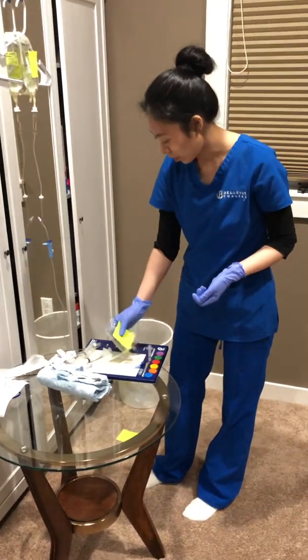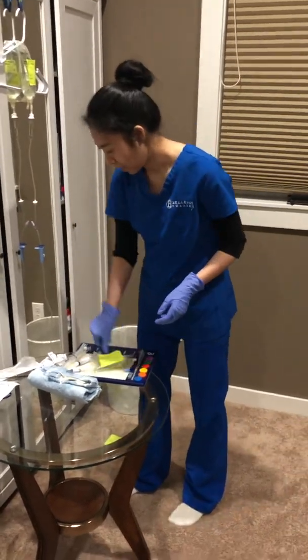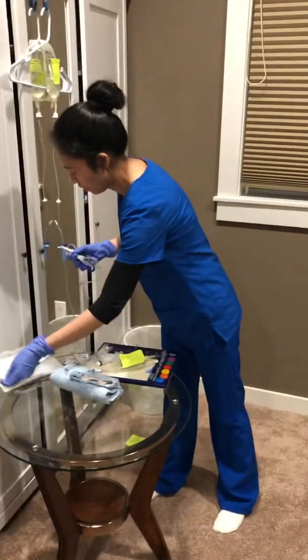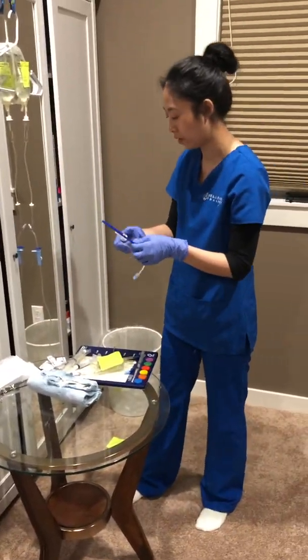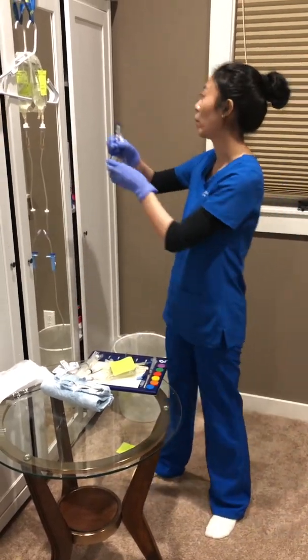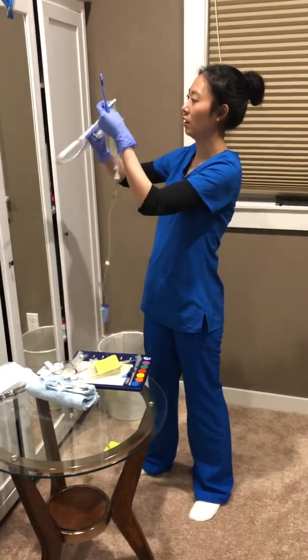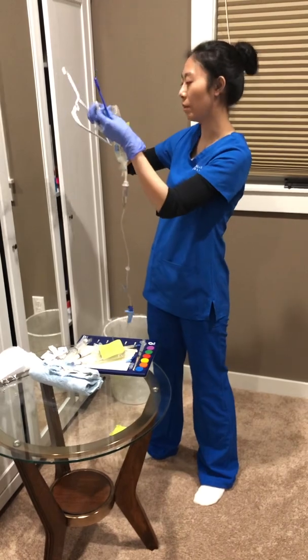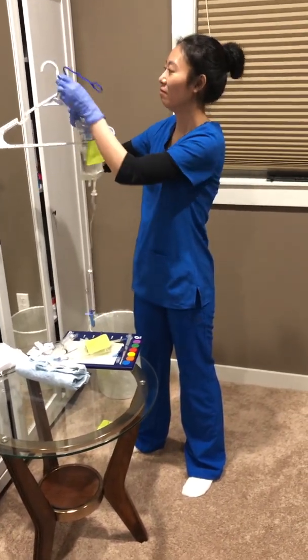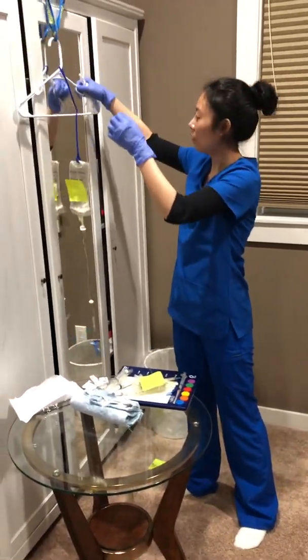Okay, now I'm going to give you the cefazolin IVPB. So I get the secondary IV set, and then make sure the primary one is lower than the secondary one, lower than the IV piggyback bag. Okay, here you go. Lower.